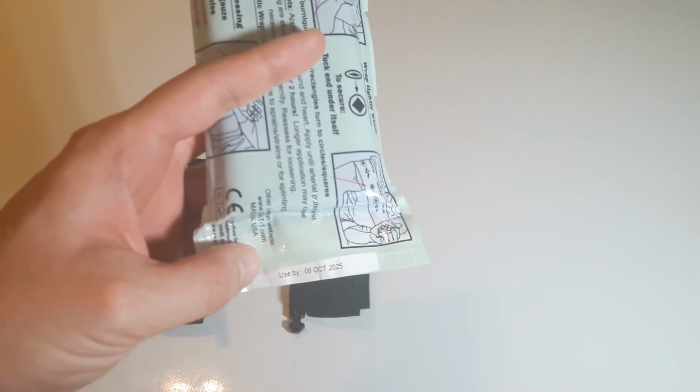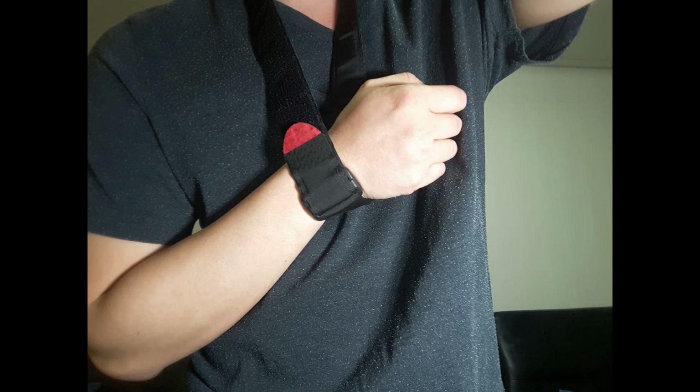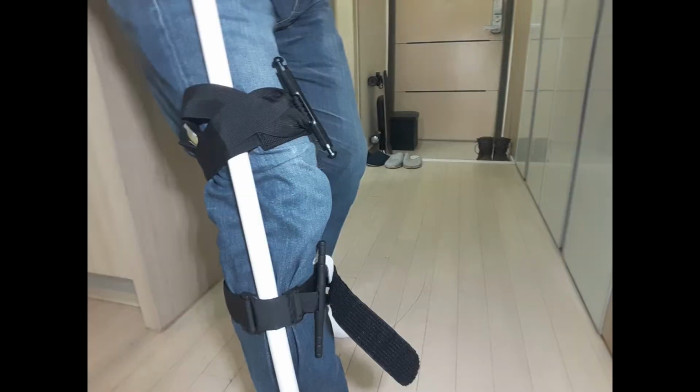The best part about tourniquets is that they have more than one use. They can be used in other medical ways, such as to hold and apply pressure to a bandage, as a sling, or to secure a splint.